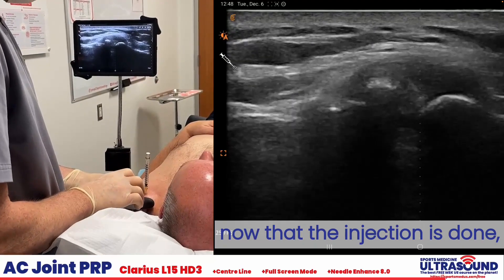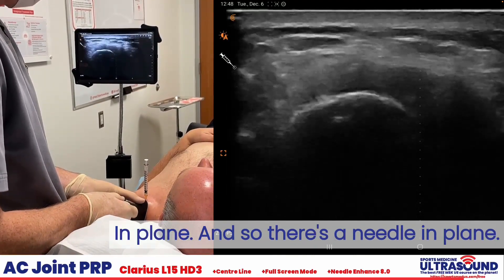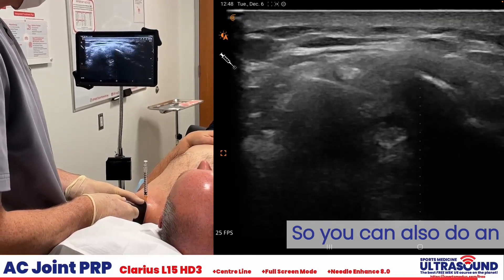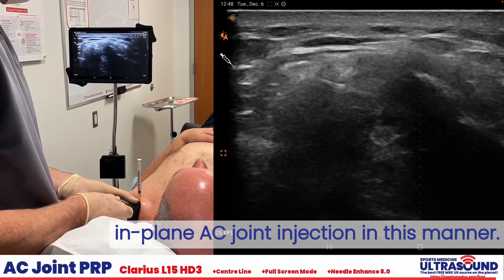And just to see it in short axis — now that the injection is done, we'll simply rotate and look for it in-plane. There's the needle in-plane. So you can also do an in-plane AC joint injection in this manner. There you go.